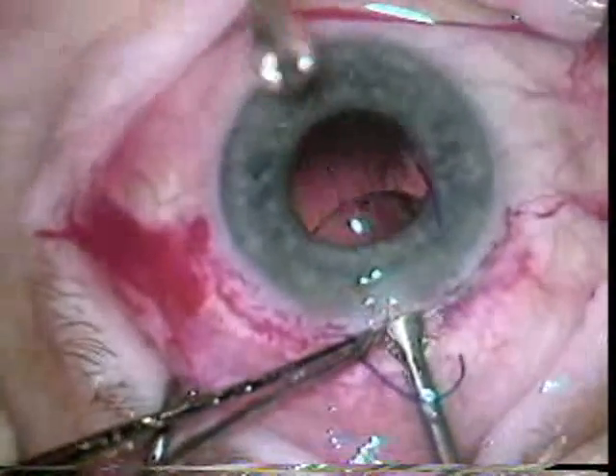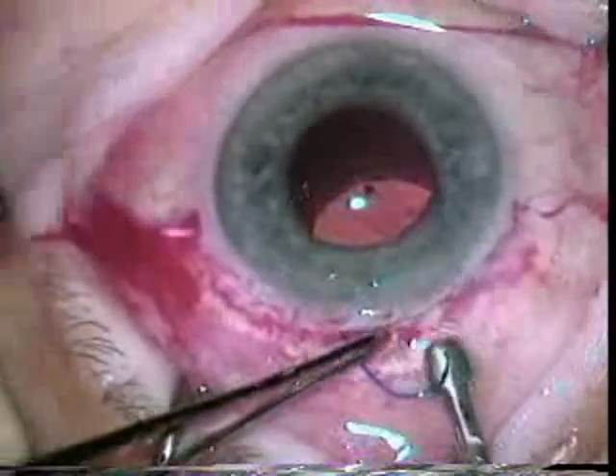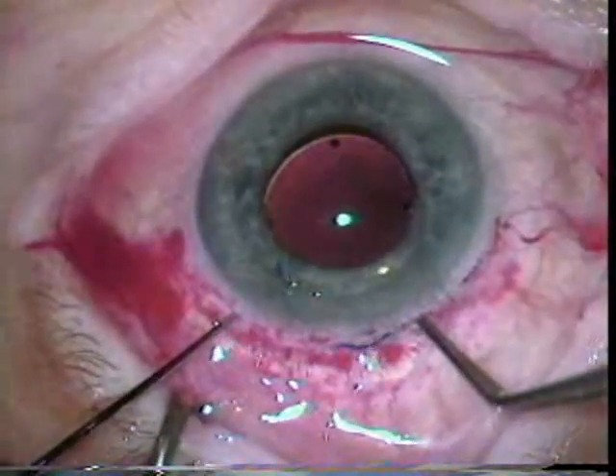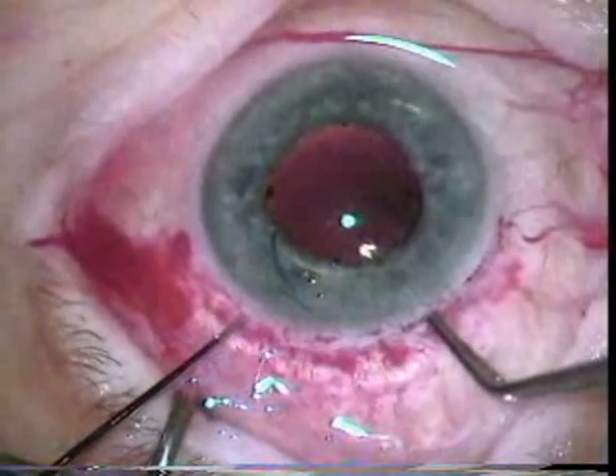The lens has four positioning holes which were useful to get the lens in just the right position. Unfortunately, the positioning holes sometimes would get in the way if the lens decentered, so positioning holes are sort of out of vogue now.